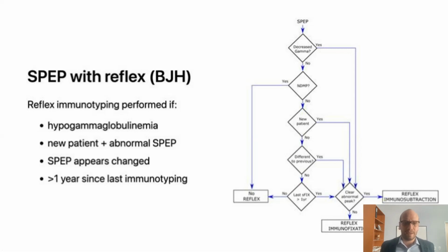There's one more indication that I've not listed here. If the clinicians order a separate standalone immunotyping, we will, of course, honor that request.